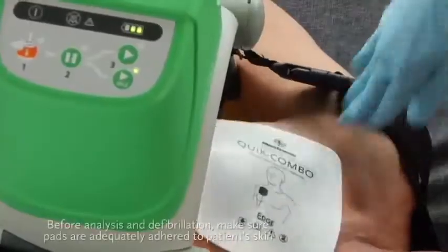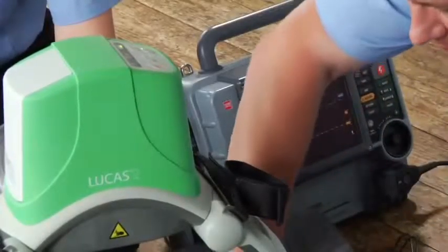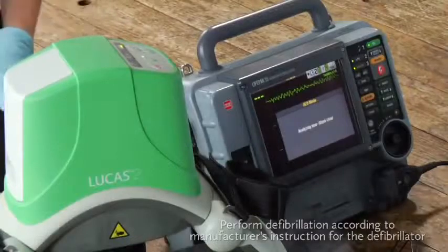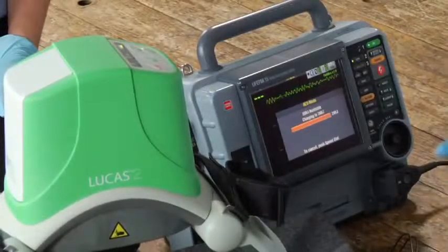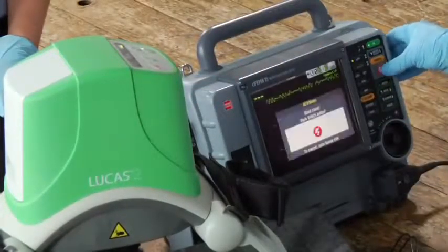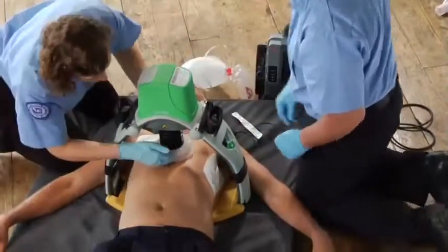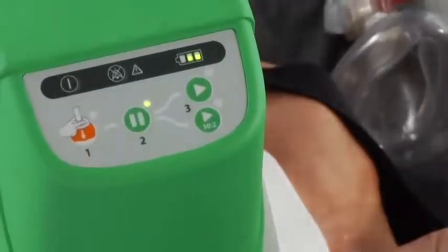You can defibrillate a patient without removing Lucas. Make sure defibrillation pads are adequately adhered to the patient's skin and that no pads or wires are under the suction cup. If the patient already has pads on, you might need to replace or reorient them. During a rhythm check or AED analysis, push the pause button to stop compressions — make the interruption as short as possible. Use your defibrillator according to its manufacturer's instructions and your protocols. After the shock is delivered, verify the suction cup hasn't moved out of place and readjust if needed. Push the active button to resume compressions.